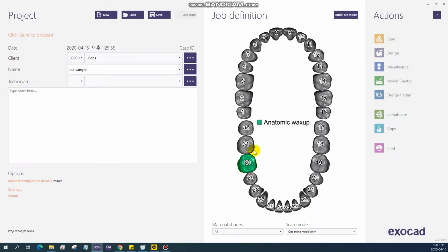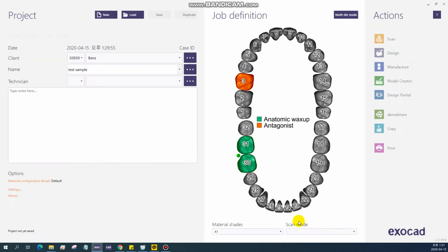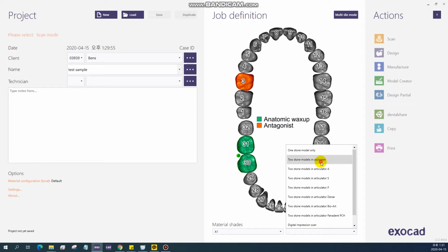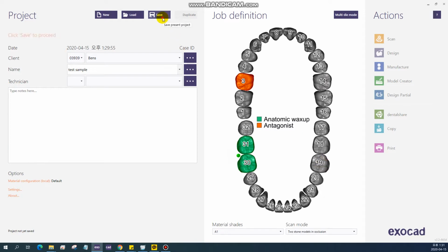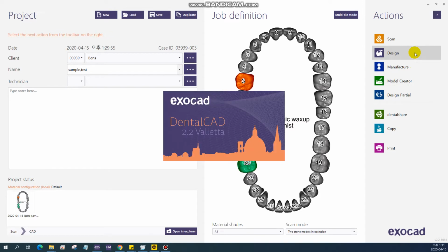And for the other abutment, I need to make it as anatomy wax up. So control buttons on it and click it. I have to make it as bridge and antagonist. Okay, then I pick two models in occlusion, maybe yes, and now we can start designing.